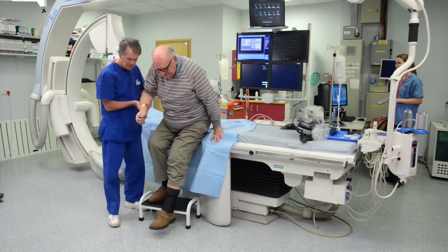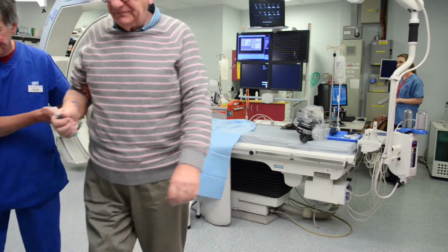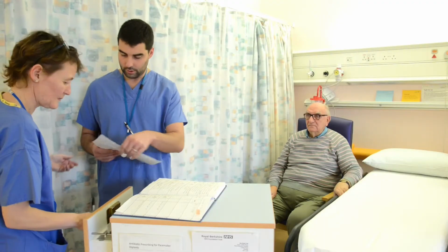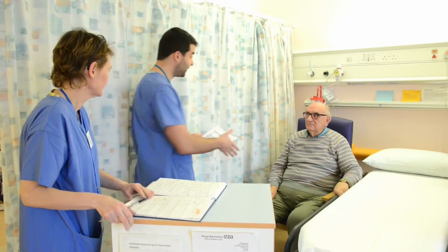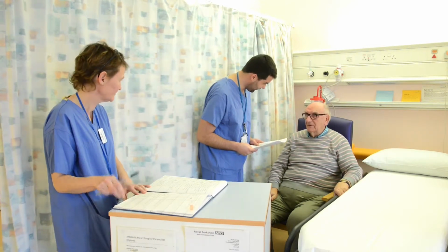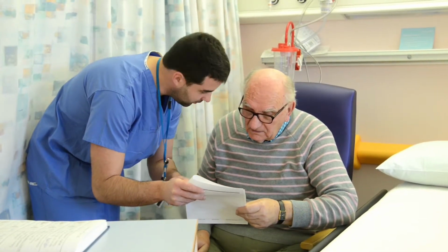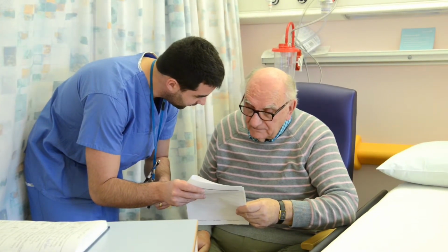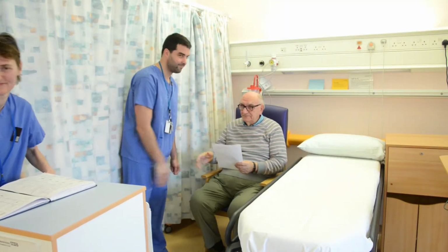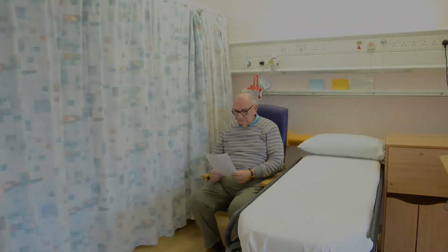After your procedure, you will be taken back to your bed space where staff will monitor your blood pressure and pulse. We will also check the wound and circulation of blood in the limb that was used. Prior to your discharge, the doctor will explain the results of the angiogram and tell you about any further treatment if necessary. You will be given a discharge booklet which will explain what to do when you get home. Please do not hesitate to ask questions at this time.